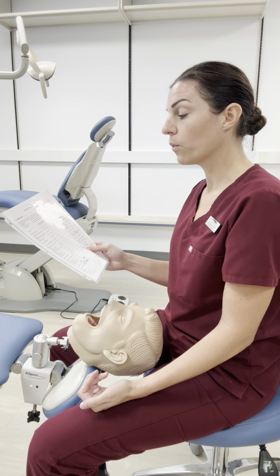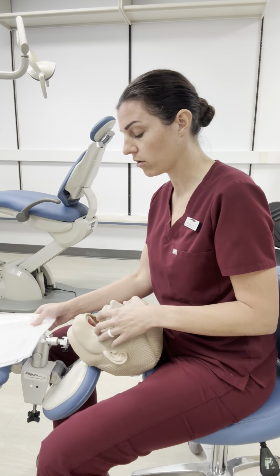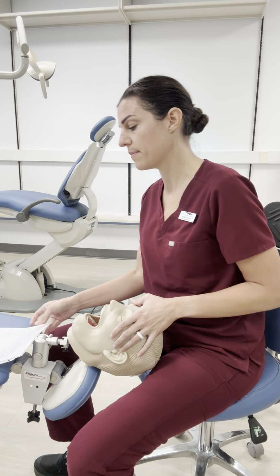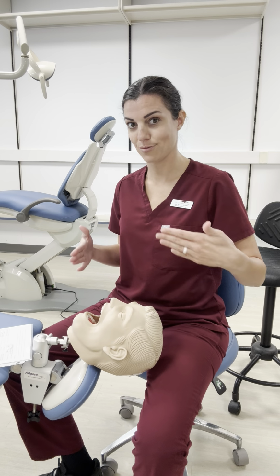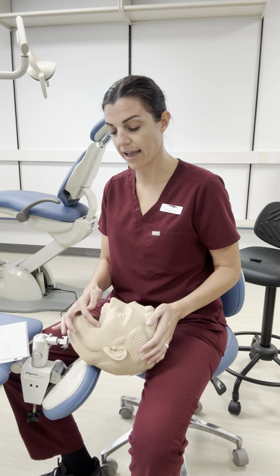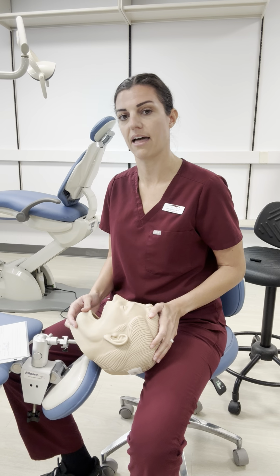Maxillary left buccal, we're going to be in that 10 to 12 position. Okay, so the maxillary left buccal is all the surfaces on the buccal side of the patient on the maxillary. Okay, so I'm going to be in that 10 to 12 o'clock position. So in between 9 and 12, right? 10 to 12. Okay, the patient's going to be chin up and towards the operator. That way I can see these surfaces a little bit better. So chin up and towards me slightly like that.